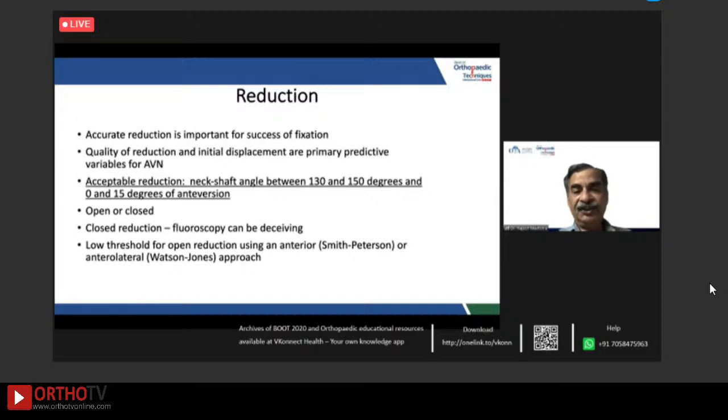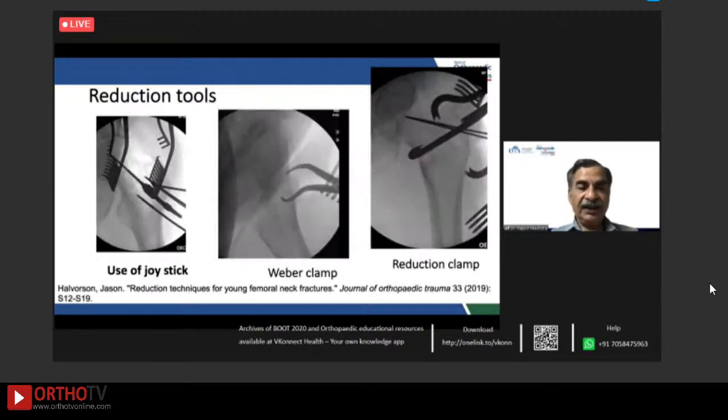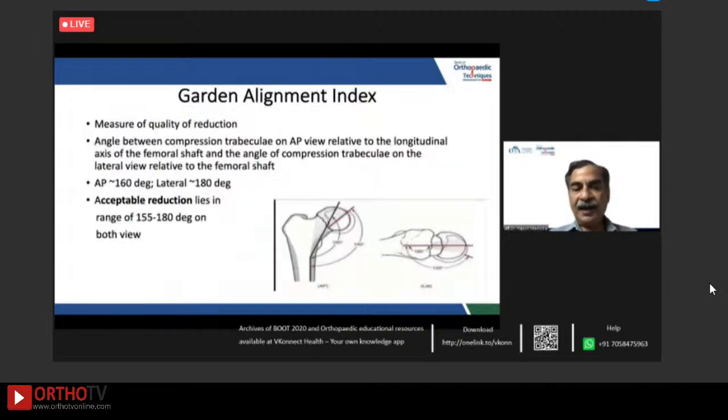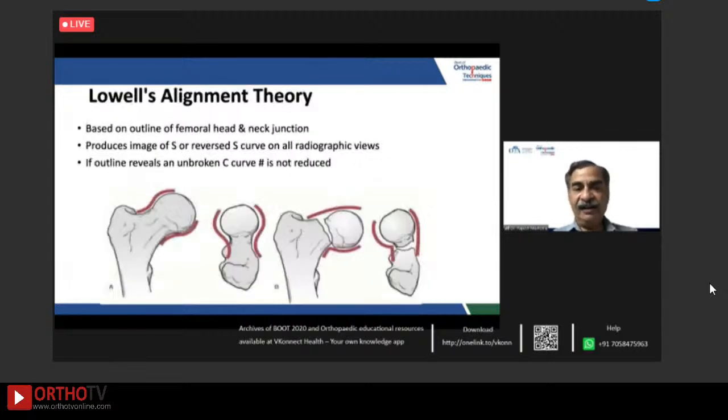So acceptable reduction is a neck shaft angle of 130 to 150 degrees or 0 to 15 degrees of anteversion. You should have a low threshold for open reduction. You have a whole lot of reduction tools. You can use the joysticks, the Weber clamp, the reduction clamp, the femoral distractor, or the Youngblood clamp. And we are aware of the Garden Alignment Index of 160 degrees on AP and 180 degrees on lateral.